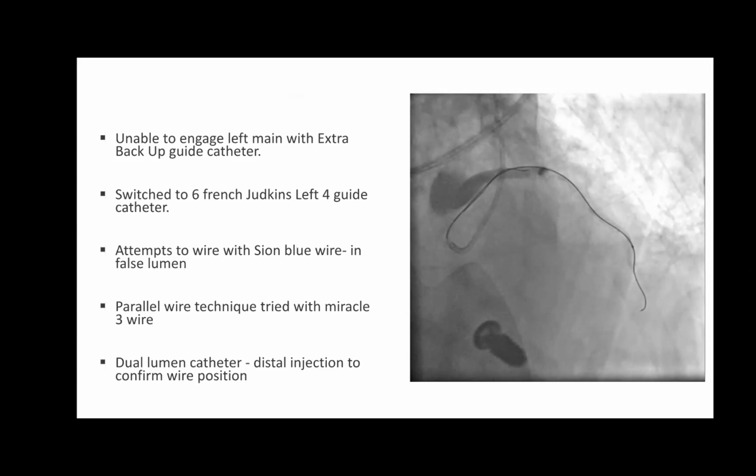So in all this chaos, another mistake, if you see on this side, so this is the next slide. Because for putting automated resuscitation equipment on, you have to lift up the patient. So we lost the guide position at that time to start the resuscitation.